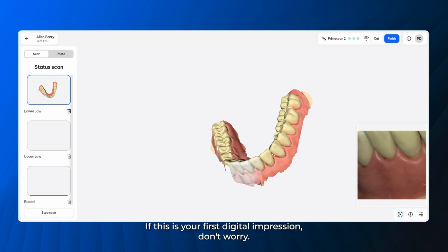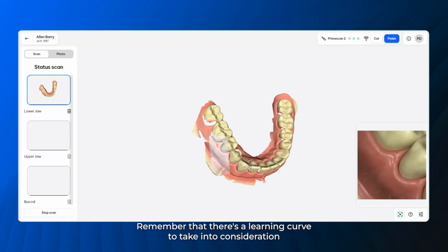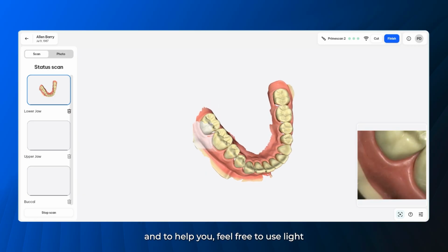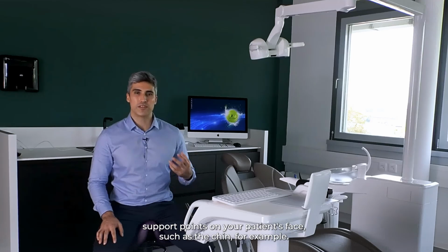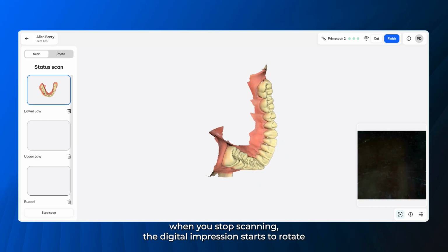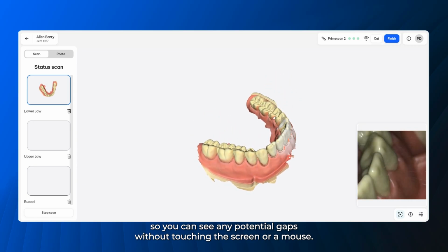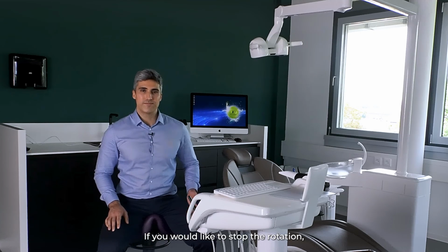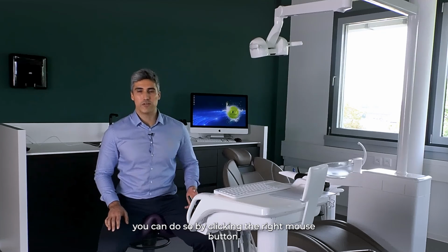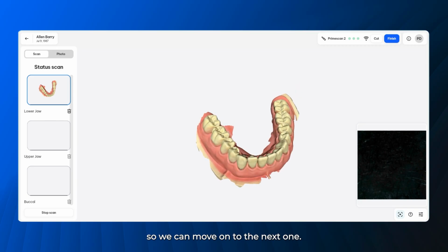If this is your first digital impression, don't worry. Remember that there's a learning curve to take into consideration, and to help you, feel free to use support points on your patient's face, such as the chin, for example. When you stop scanning, the digital impression starts to rotate so you can see any potential gaps without touching the screen or a mouse. If you would like to stop the rotation, you can do so by clicking the right mouse button. In our case, the digital impression is complete, so we can move on to the next one.